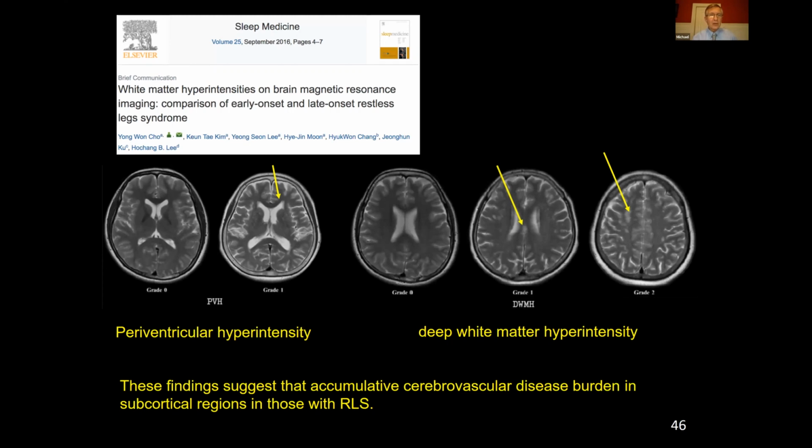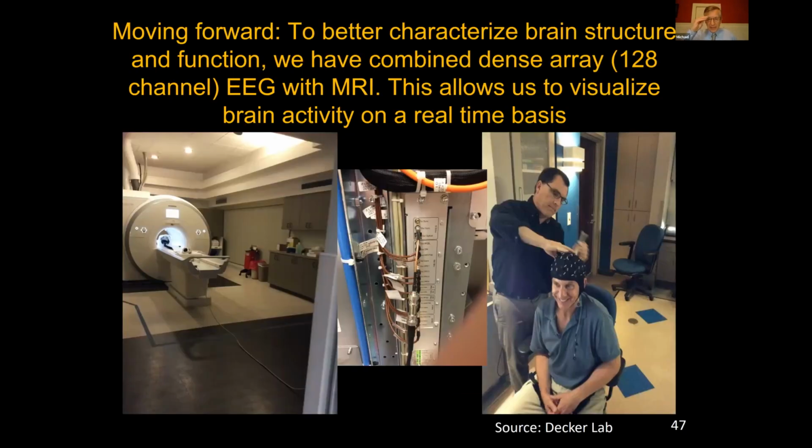Last couple slides. Some of the work we're doing now is looking at hypoxia and high altitude. So we took the 3T scanner down in the MRI suite and connected our EEG system to it. When we first did this, Mark Griswold said, Decker, if you break my scan, you're in trouble, because we actually have to connect our EEG system into the hardware of the scanner itself. Since this hadn't yet been done, we had to put a bowling ball, or phantom, in the scanner with a head cap on to make sure it didn't absorb enough energy to heat the bowling ball or cause any damage. The bowling ball survived, so I was the next one to go in.